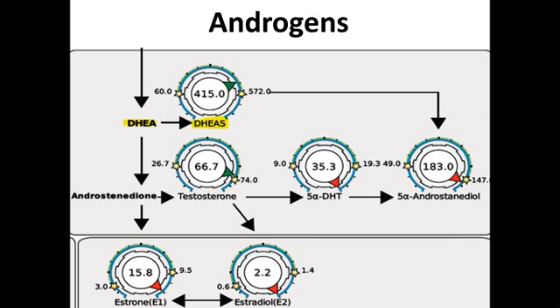But that's a little bit misleading because it's so predominantly the sulfated version of DHEA that we're reflecting in the urine levels. That's an important metabolite, and has been shown to be higher in, for example, older individuals that are healthier. So usually that's an important metabolite to be looking at in your patients, both male and female alike.